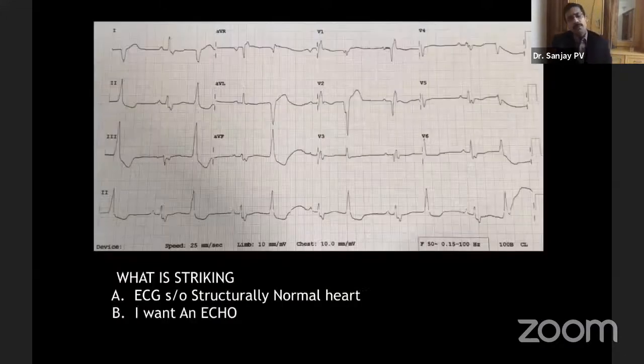So coming to this patient again, this was a very interesting case. We were all worried, why is she having this slow VT, which was in fact very incessant? So we put her on Cordarone, she did not respond. We had to give Xylocard and then put her on mexiletine. So this was the ECG after a couple of days, when we reduced the pacing rate to 30 because I wanted to see her intrinsic conduction.